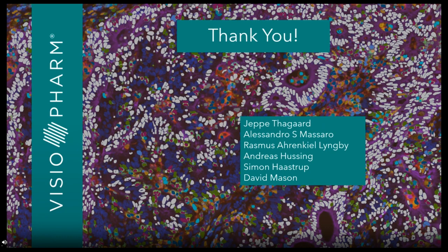Thank you, Dr. Vasaturo. I'm sorry, I'm trying to read questions and talk at the same time. So the next question is, do you have any recommendations regarding section thickness to get good multiplex staining as well as cell detection? Well, I can talk through the thickness for staining. We usually work with the classical 3 to 5 micron slide.